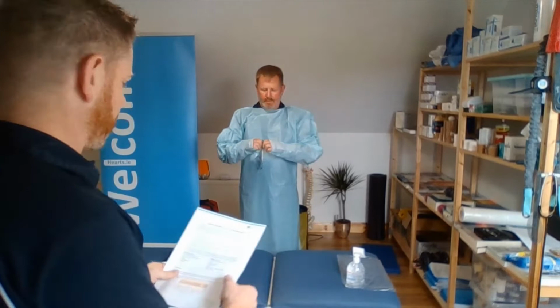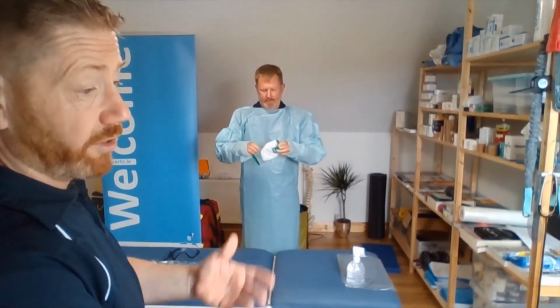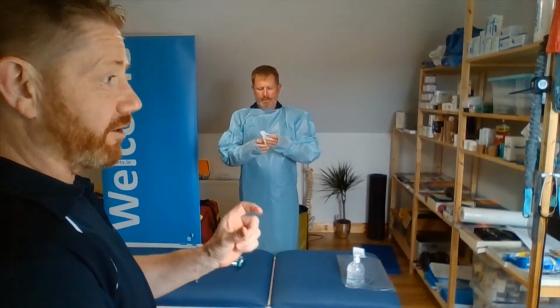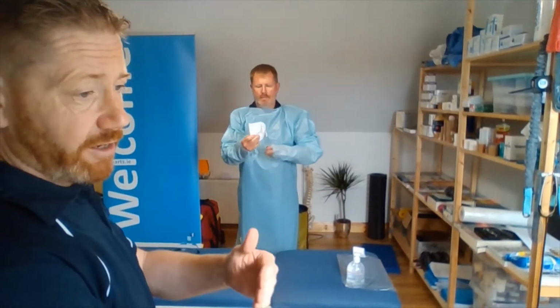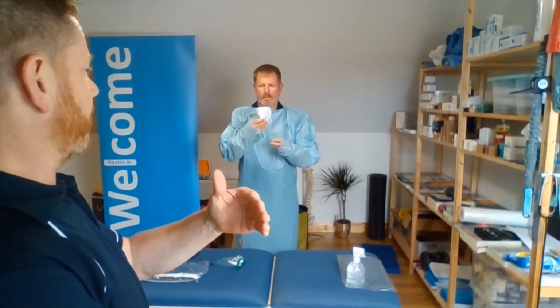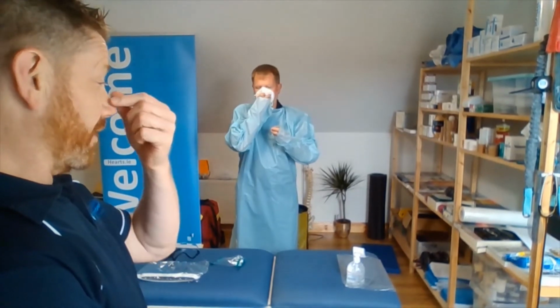The next thing he's going to look at is the type of mask we call an FFP2, which under the Pre-Hospital Emergency Care Council guidelines is the standard of mask you should have on when providing first aid assistance. Again, this is based on you having to close in and enter a space closer than 2 meters. Sean is now placing the mask.